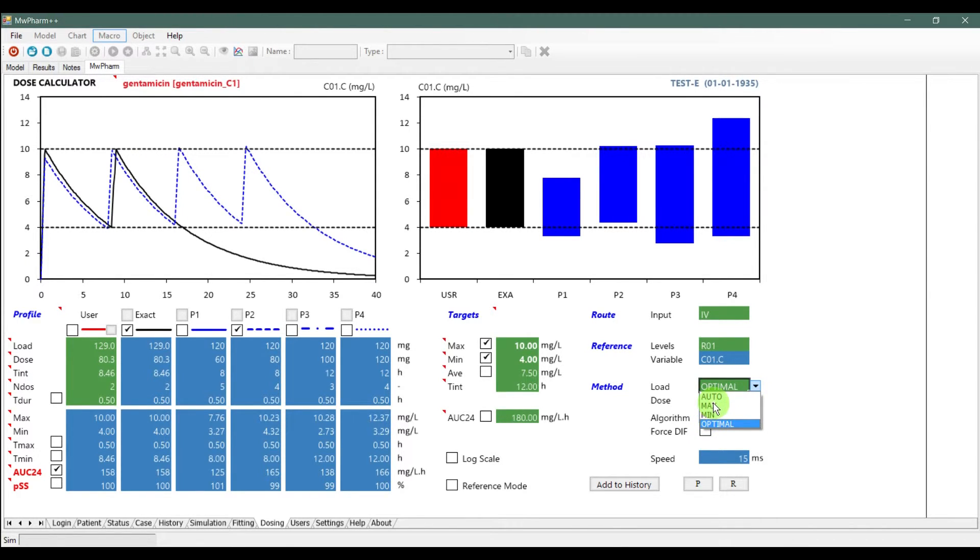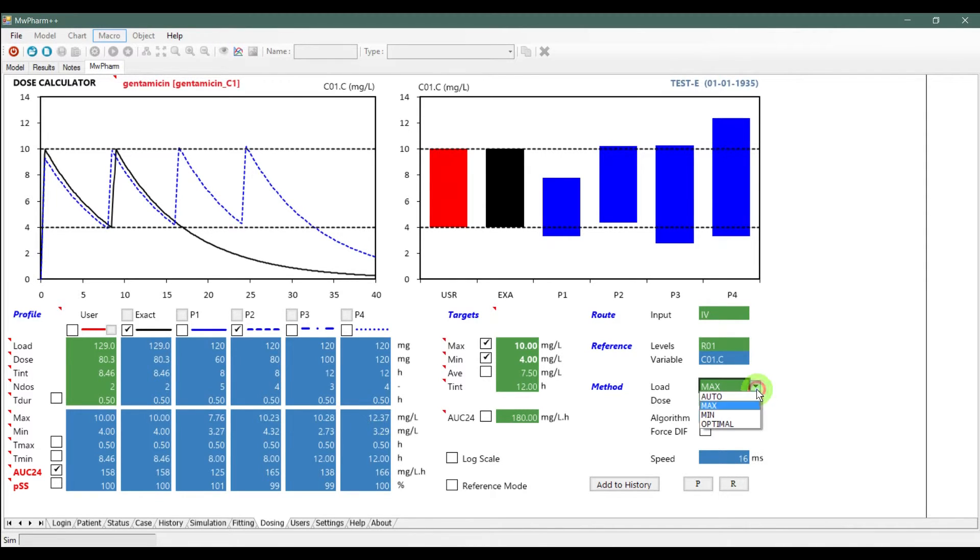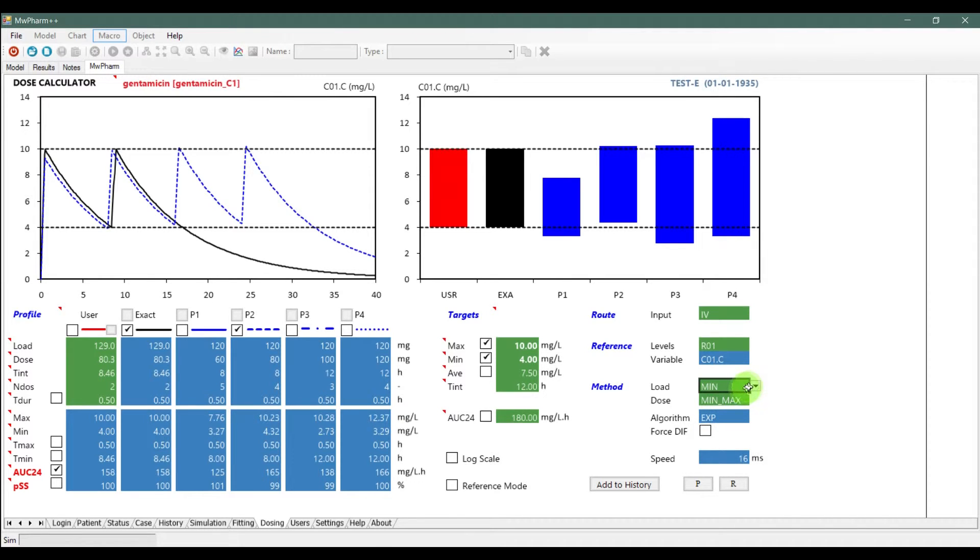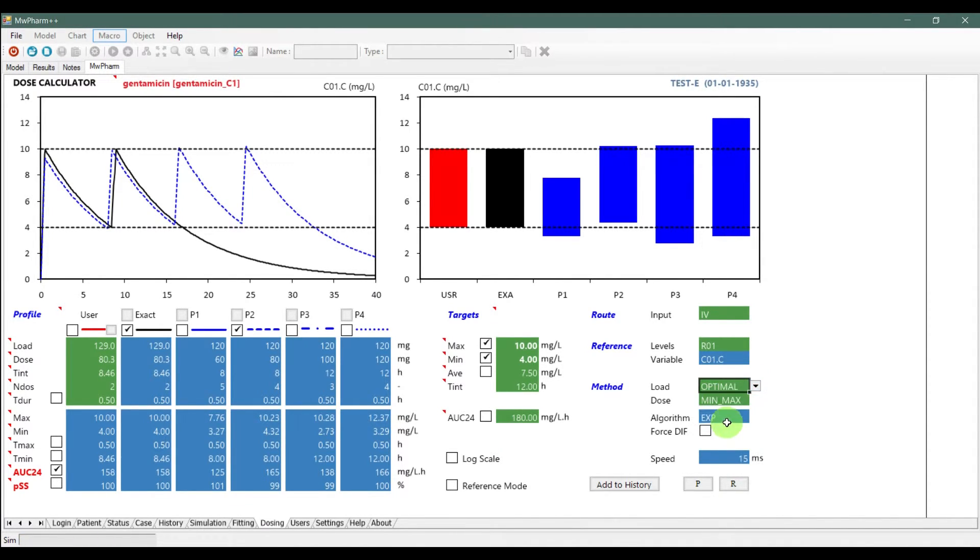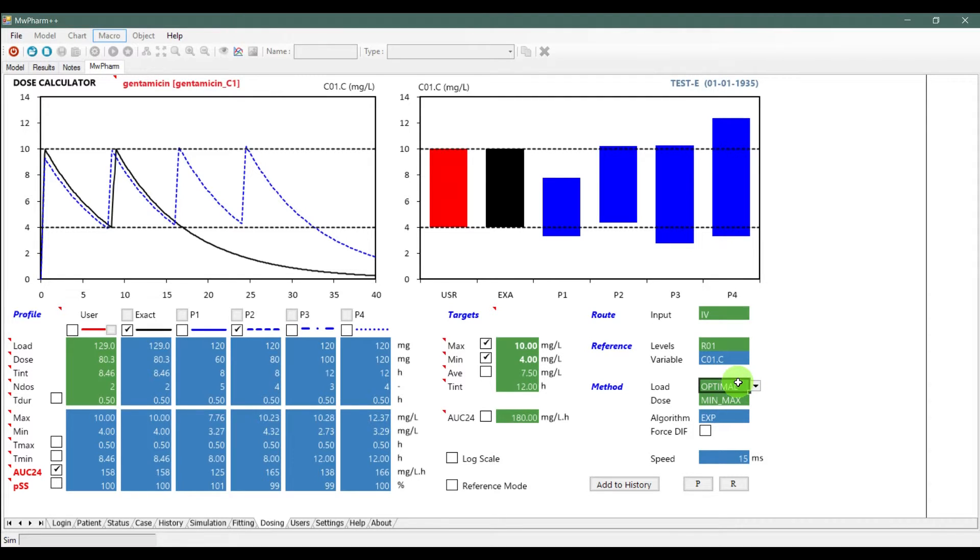This setting will keep the concentration at optimum values. If you choose D-Auto, concentrations are automatically recalculated. If you choose minimum or maximum, concentration will approach the minimum or maximum value.